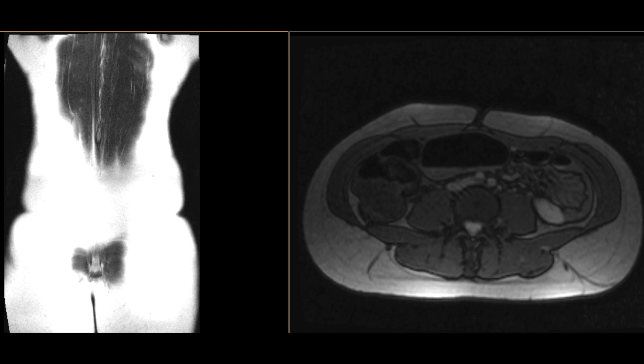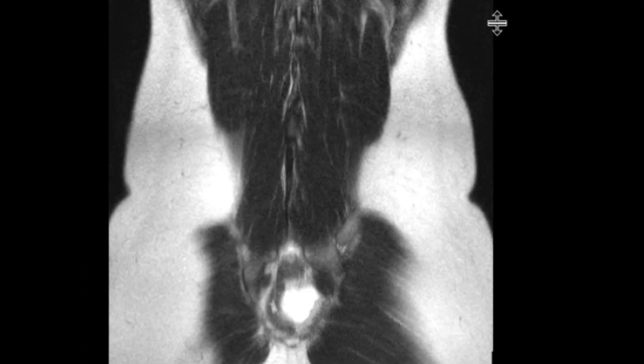This is a patient who is pregnant in their first trimester and had come in with a history of abdominal pain. An MRI was performed to look for a cause of it, as they were worried about acute appendicitis.